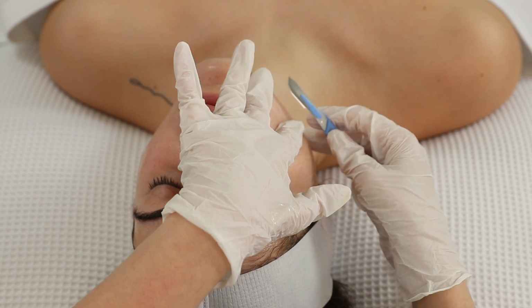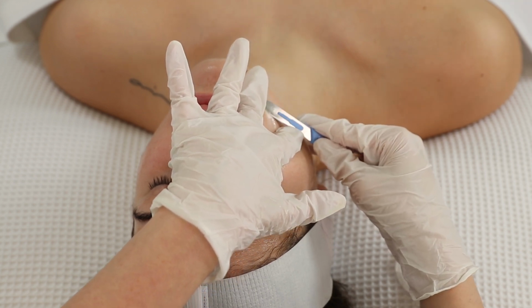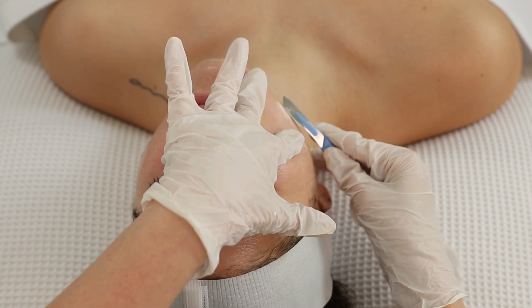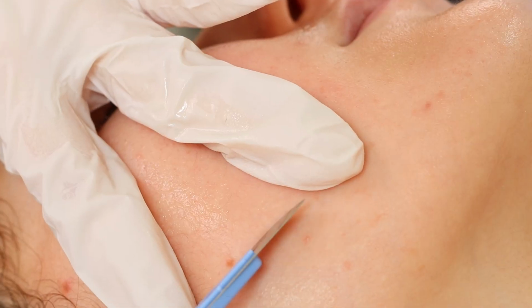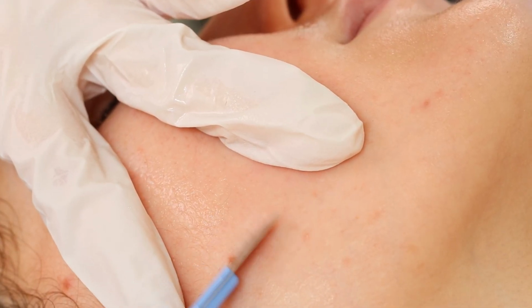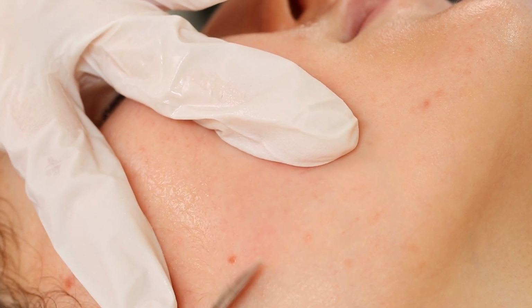Start from the right side of the face near the chin area, making sure that you are stretching the skin at all times. Place the curved part of the blade onto the skin and position the blade at approximately 45-degree angle. We're using very quick and small strokes going upwards and only using the blade within the stretched area of the skin.